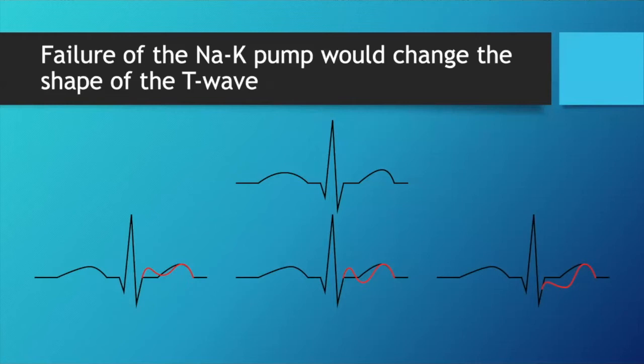But we ignored the biphasics. No, we didn't. We didn't ignore the biphasics. We ignored the episodics, not the biphasics.